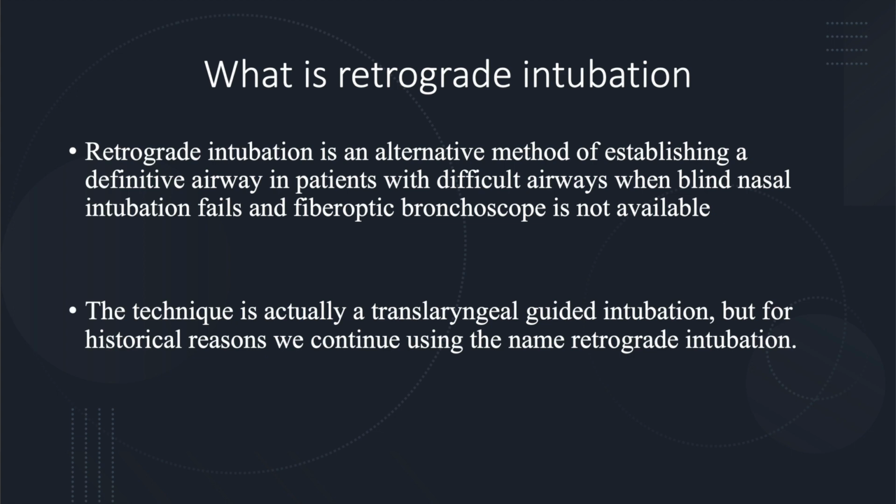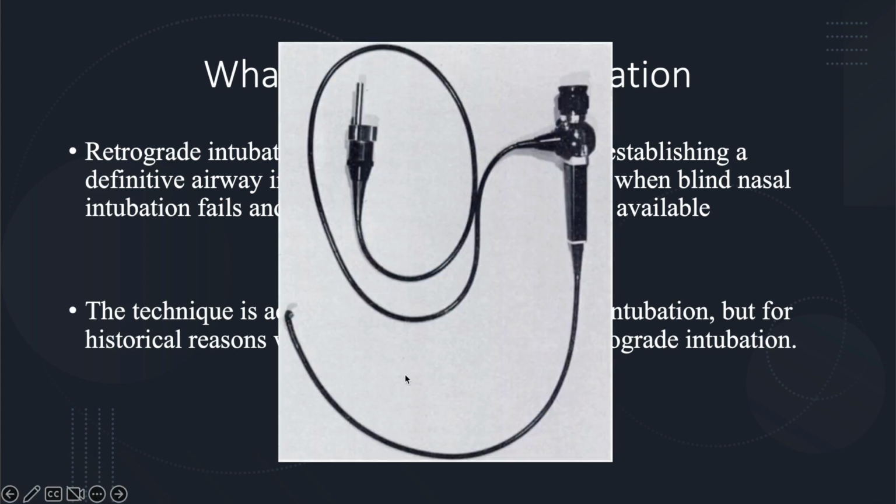As I was doing the research, I continually saw fiber optic bronchoscopes, and I didn't know what it was, so I just wanted to include this image to show anyone who didn't know what it was. This is a tool. It's used in the hospital setting and in surgical settings, and it's not really used in a pre-hospital setting, but this is what it is, and it's for intubating and visualizing the airway.